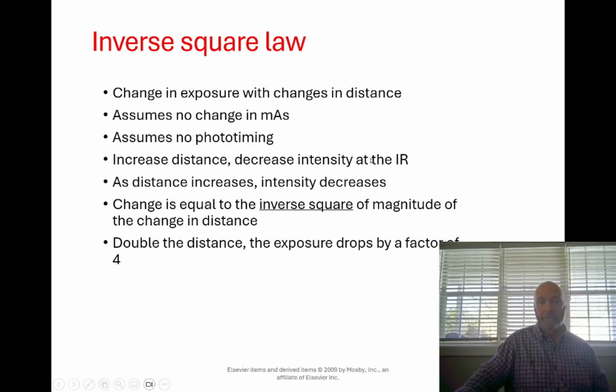In a practical sense, what you do is you increase your distance from the radiation source as much as you can. So most of the time when we're talking about inverse square law, what we're talking about is not mAs, it's not even mAs equivalent, it's radiation exposure, and it's going to be read in something like mR, that's milliroentgens, millirems, or could be milligray. So how you use this in a clinical setting is you increase your distance as much as possible.